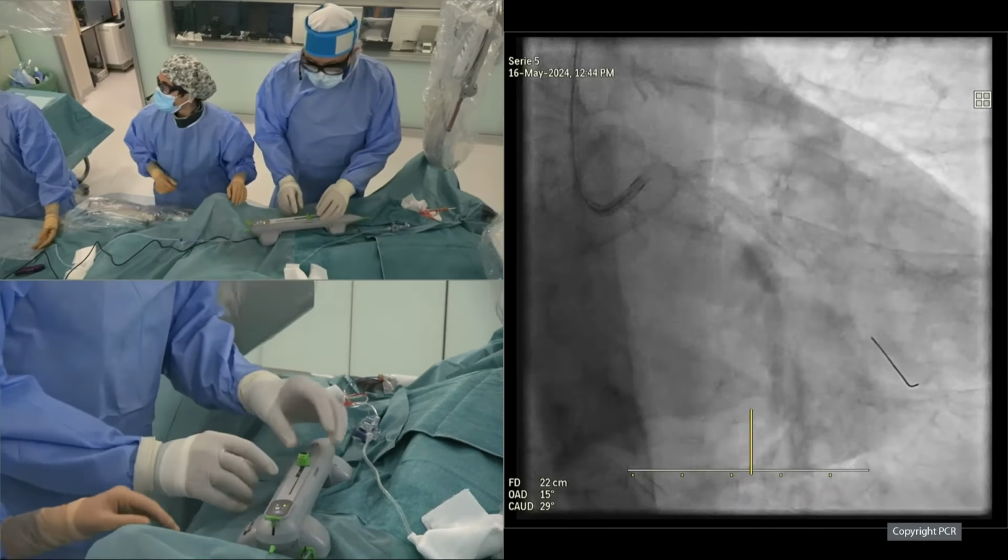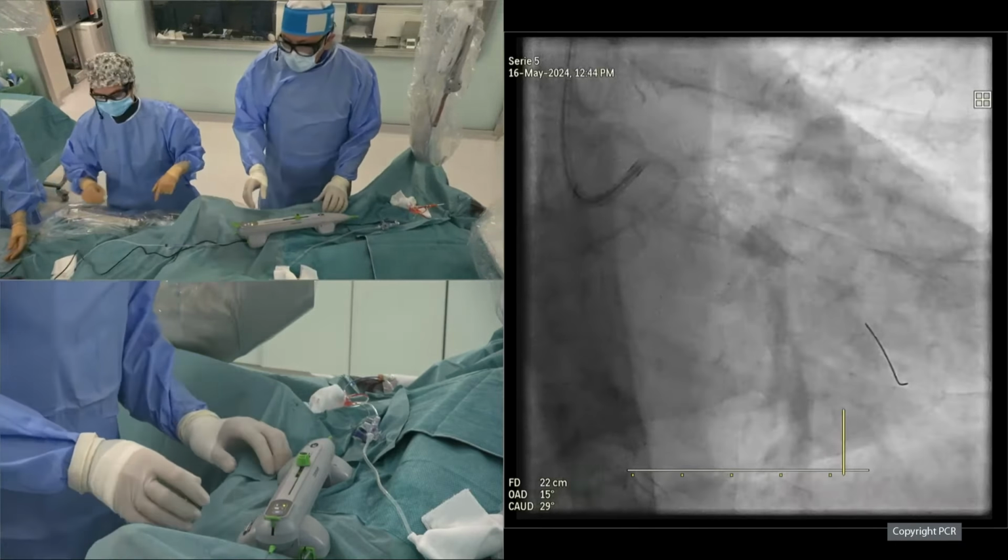We are going to do the following. I'm going to activate glide assist, and I'm going to try to advance the whole system distal to this angulated segment. I have to keep the brake off, and I'm going to try to cross it very carefully. Nieves is going to play a very key role here, because she must at the same time keep the wire in place, but also perhaps apply a bit of tension. Okay, so I'm going to do it now. Okay, I'm in glide assist.